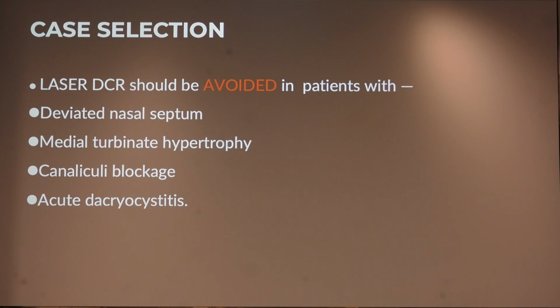Case selection is again very important. It should be avoided in patients with deviated nasal septum, medial turbinate hypertrophy, canalicular blockage, and acute dacryocystitis.